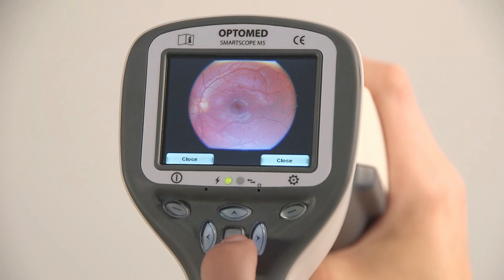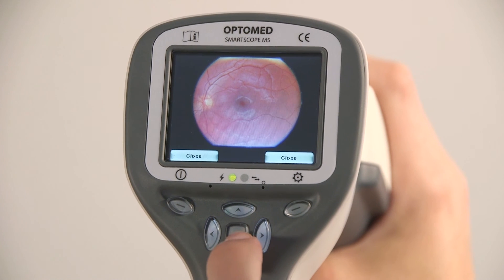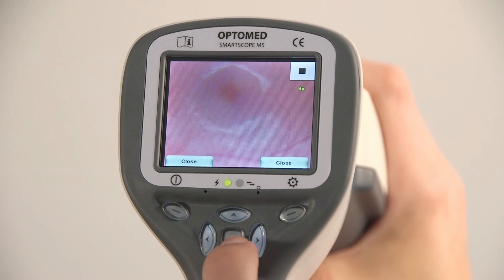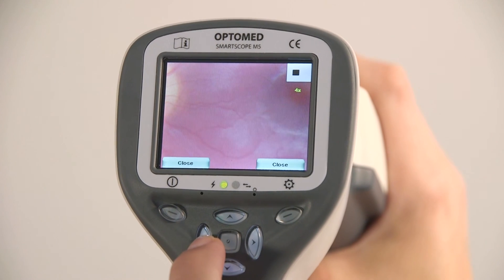The taken image is displayed on the screen until the user clears the image by pressing the shutter, left, or right soft key. The image can be zoomed in the instant preview by pressing the middle key. There are four zoom levels, and pressing the middle key activates the next level. Move around the image by using the arrow keys.